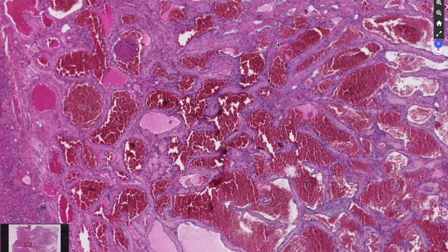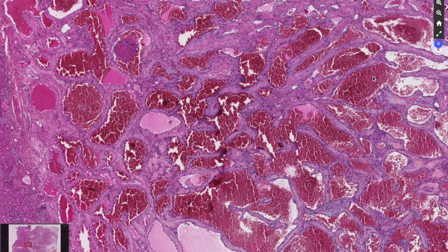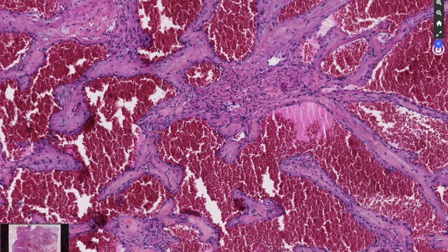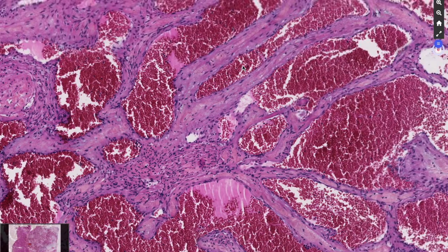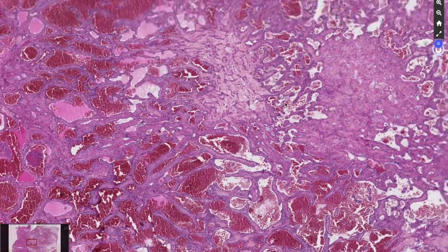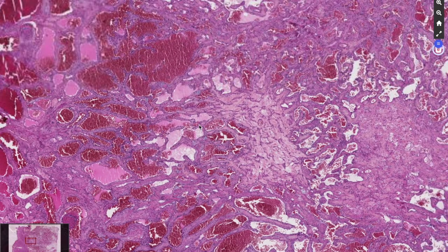So you can see that the tumor is composed of vascular spaces that are filled with red blood cells, and there are some small fibrous walls, and here you have the endothelial cells that completely lack atypia. And when you go to other sections, other areas, you have these fibrotic areas that are likely due to recent thrombi. And so this case was a hemangioma.